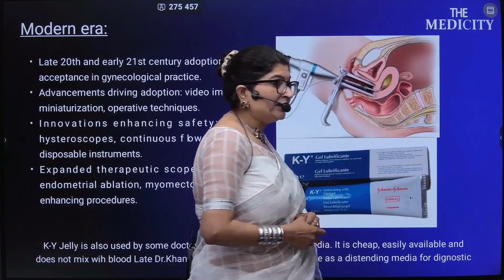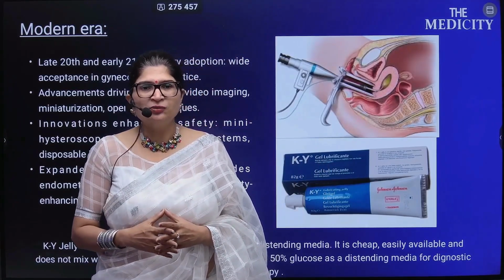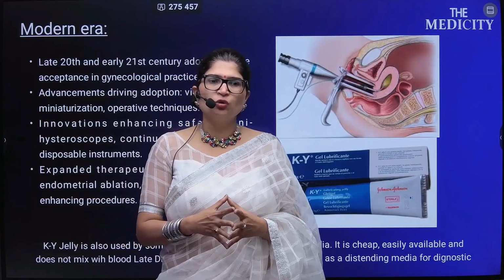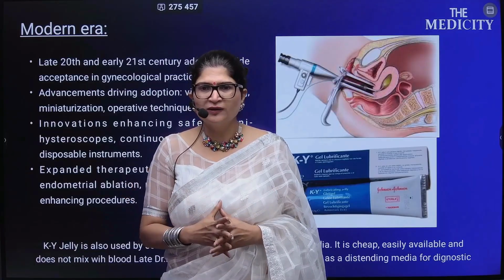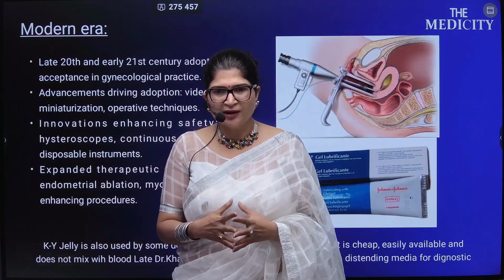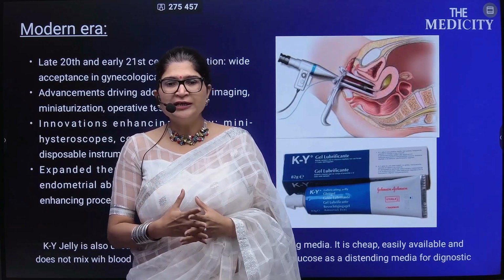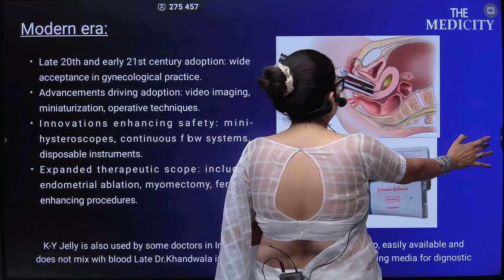In the late 20th and early 21st century, there was wide acceptance in gynecological practice, with advancements driving adoption, such as video imaging and operative techniques used in hysteroscopy. Innovations enhancing safety were also developed, and disposable instruments are now used in hysteroscopy, which can be discarded after one use in surgery. So, better sterilization, better safety to the patient, and advancements. And in expanded therapeutic scope, there were different therapeutic approaches, such as endometrial ablations, myomectomy, and other operative surgical skills used with the help of hysteroscopes.